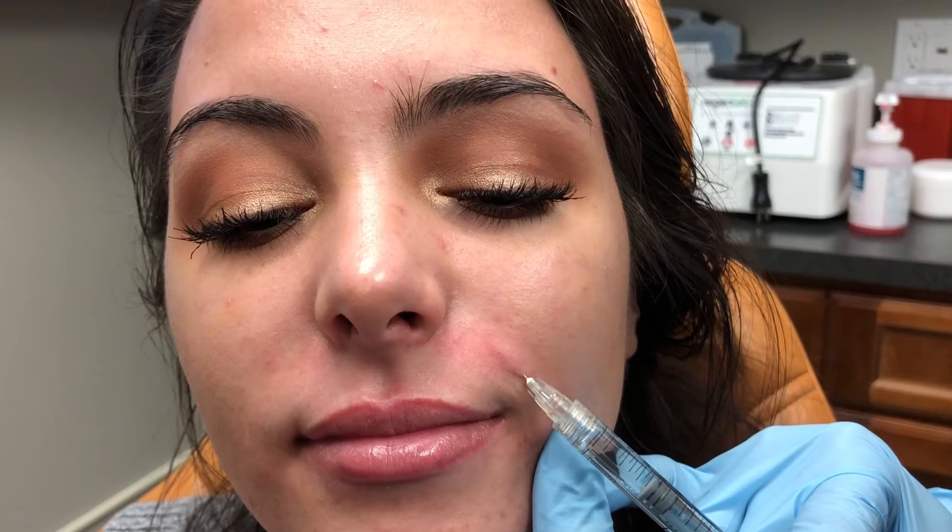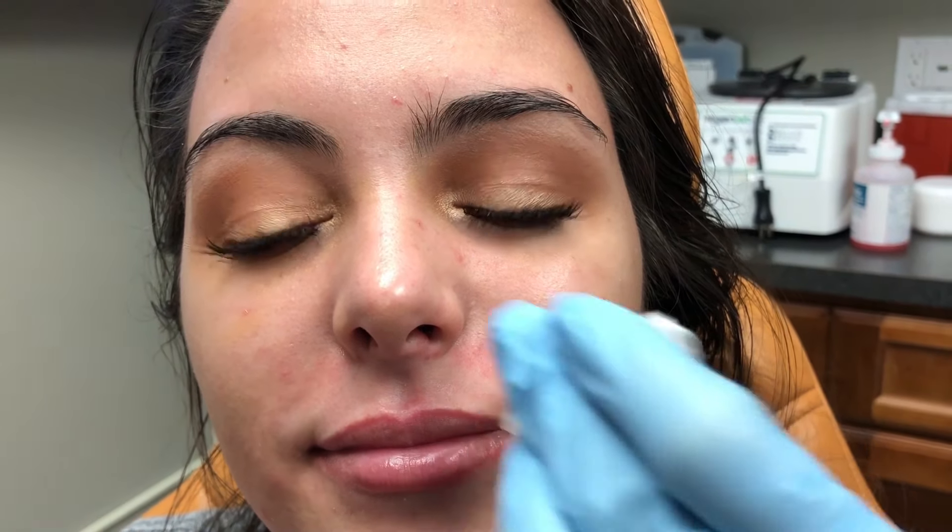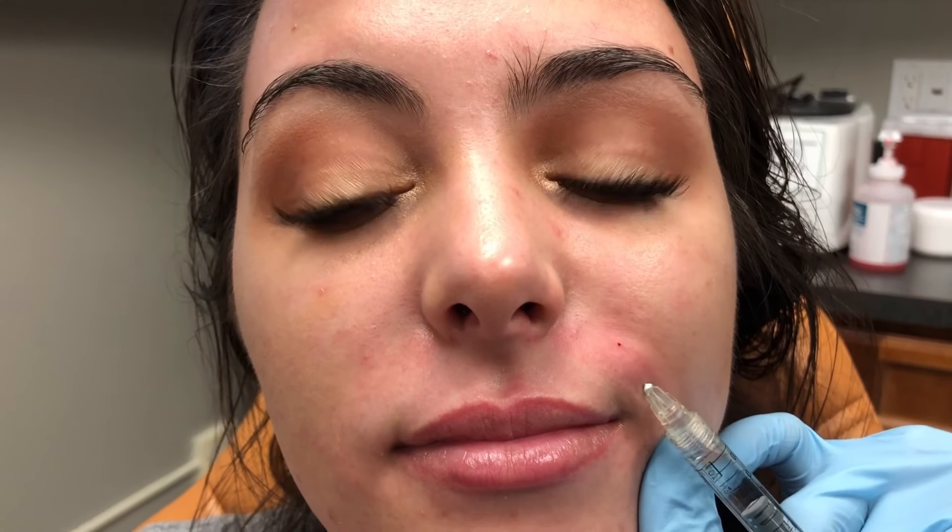Going from where I last injected, I'm going in, tenting up — I like my plane — and I'm going to continue to fill with a slow retrograde. It's starting to look good. I'm going to go through at the end and smooth everything out, and I'll show you that as well. Just relax — tenting up and slow retrograde.